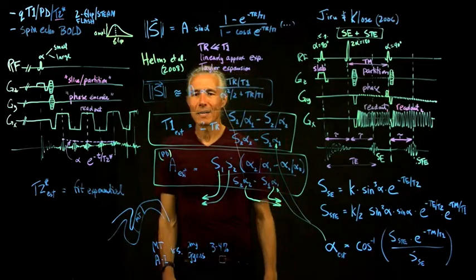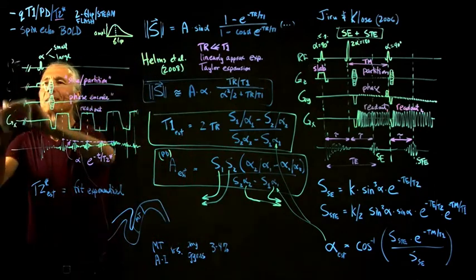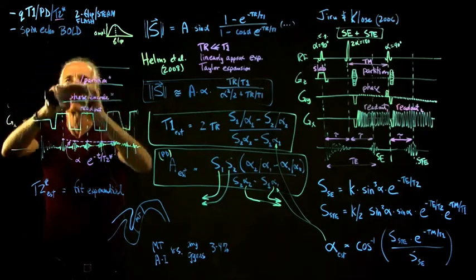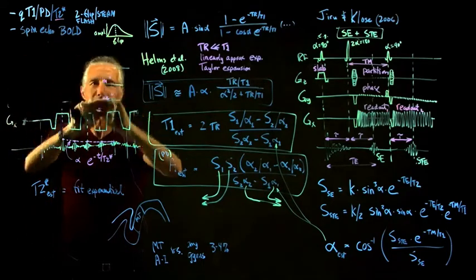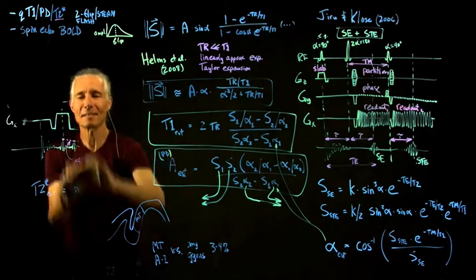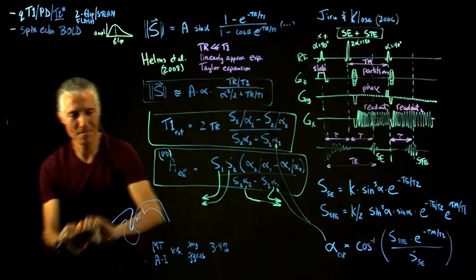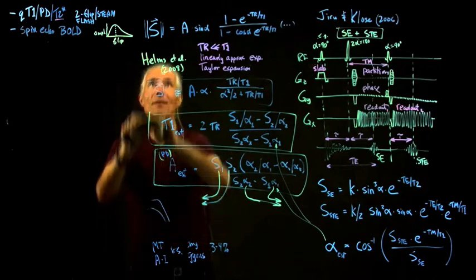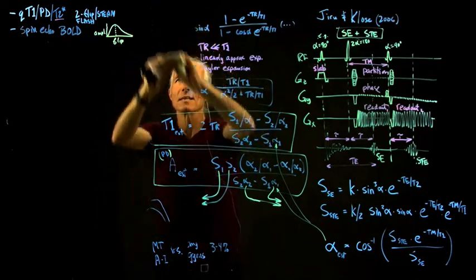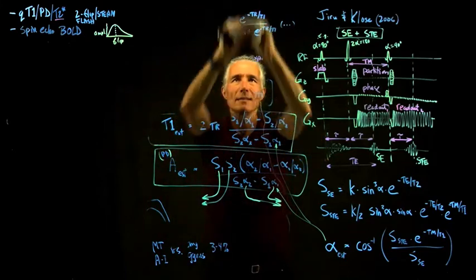Okay, so that was quantitative T1, two flip angle, multi-echo FLASH, plus STEAM, meaning stimulated echo, plus spin echo method of trying to calculate the actual T2 star, proton density, and T1 that's actually quantitative.